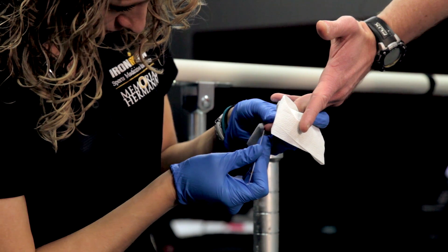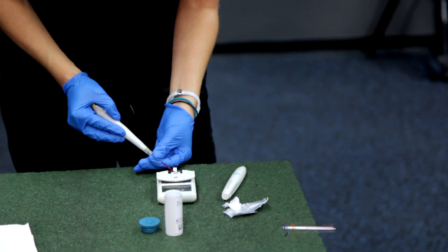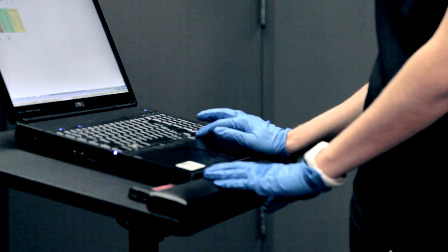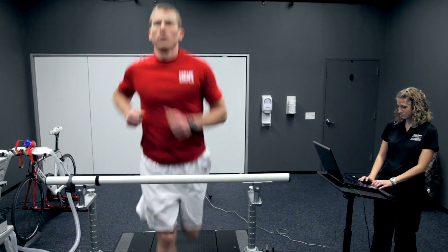Each time we're going to take a finger stick to get your blood lactate, a heart rate, and a rating of perceived exertion. From that, we'll set your training zones, and you can start training smarter and hopefully get faster.